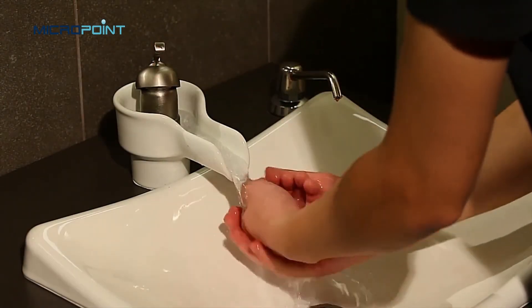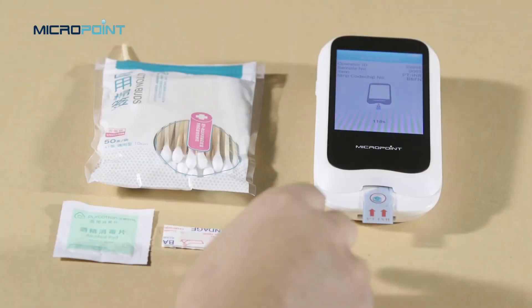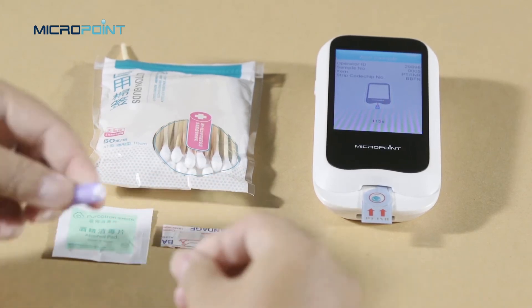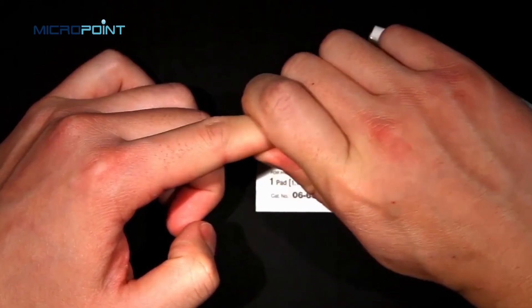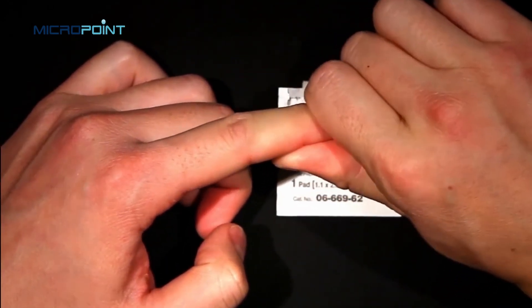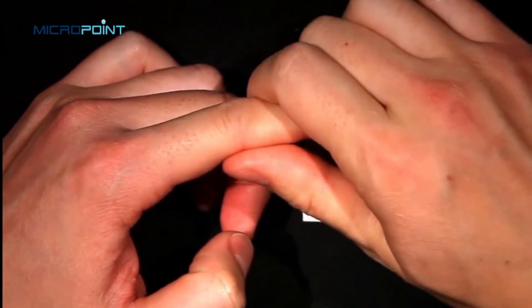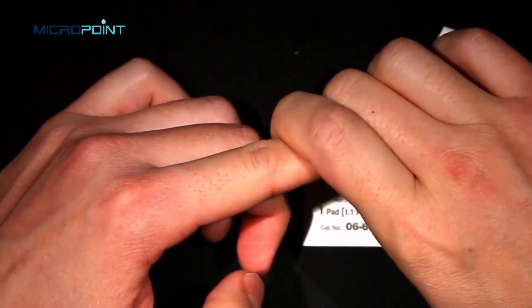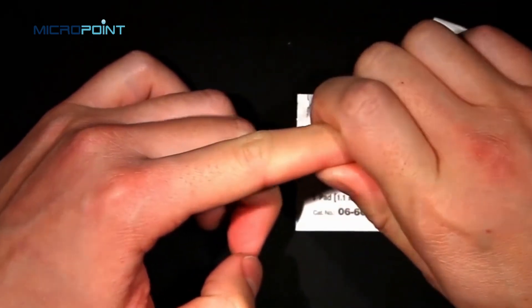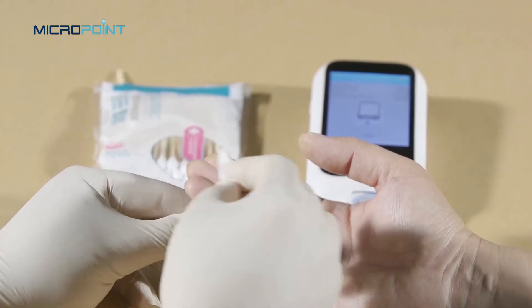Remember to always wash your hands with warm water and dry them thoroughly before you test your INR value. Take out one lancet and remove its protection cap from the top. Massage the finger with a downward motion several times before performing the finger stick. Identify a site on the finger to puncture — on one of the middle fingers of either hand, near the top of the finger on either side, away from any calluses or scars.